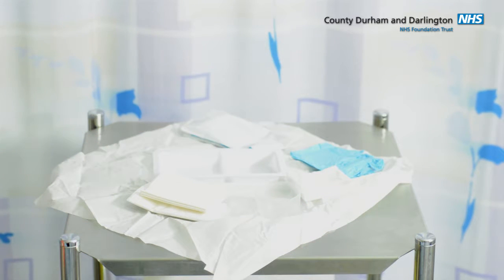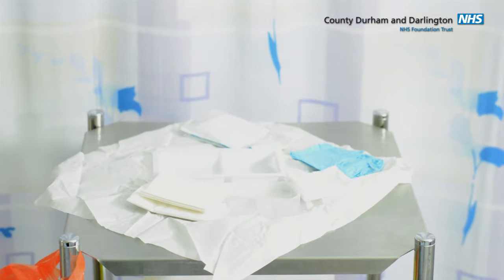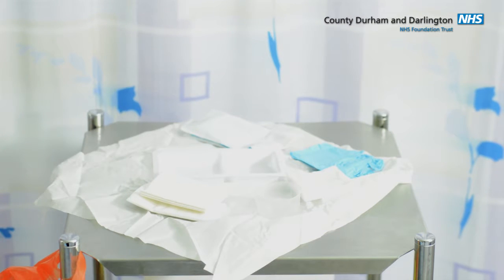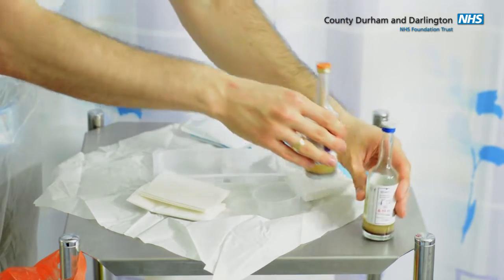Our blood culture packs are made up in our path lab. As it's not possible to autoclave the entire equipment, we must remember that they are clean but they're not sterile. So it is important to place your blood culture bottles at the side of your aseptic field to prevent cross-contamination.